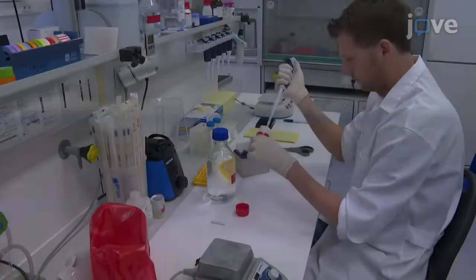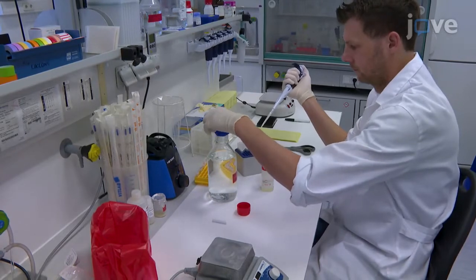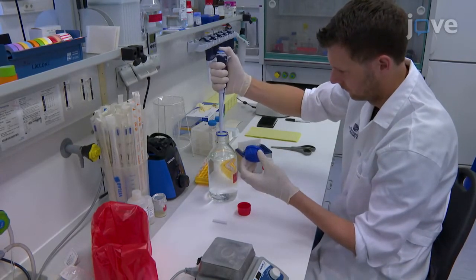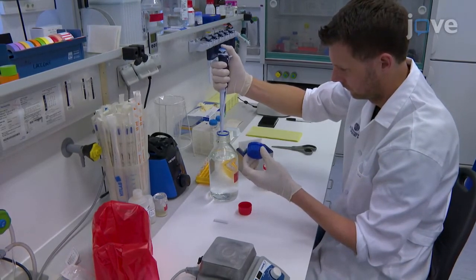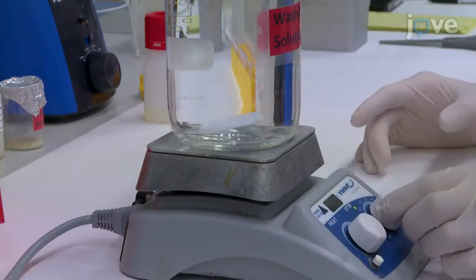To prepare the washing solution, which is 0.05% tween 20 in PBS, add 500 microliters of tween 20 to 1 liter of PBS and mix vigorously.